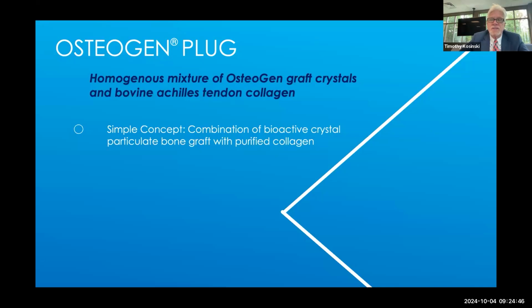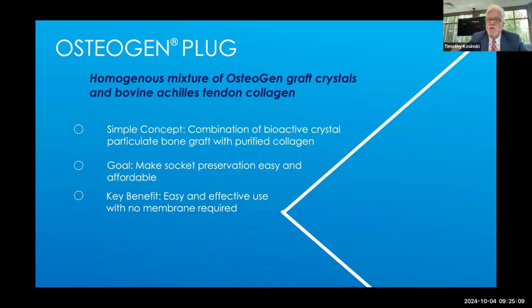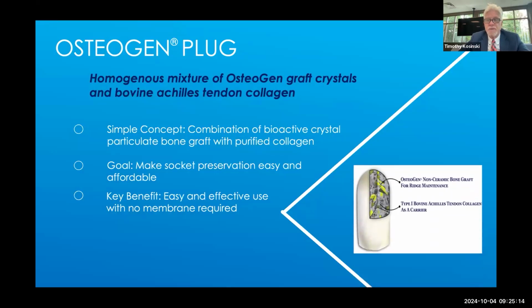So if you have any patients that are having a hard time wanting human bone or an animal bone, this is an excellent material. It's also very, very inexpensive, and it doesn't need a membrane. The material is such that I don't have to protect it from invagination of epithelium. The epithelium will follow the path of least resistance and grow over the top of the material. So these two grafts, Newport Biologic allograft material and a synthetic Osteogen plug, again from Newport Biologics.